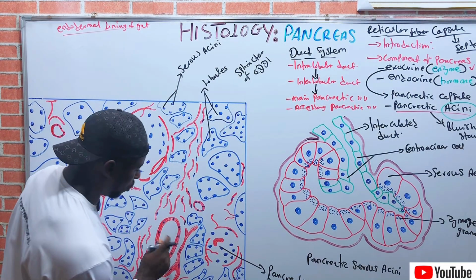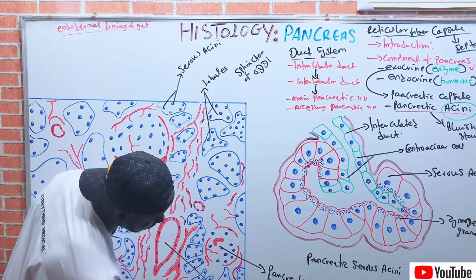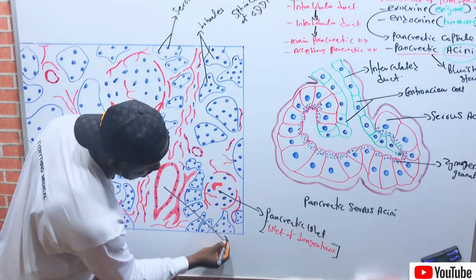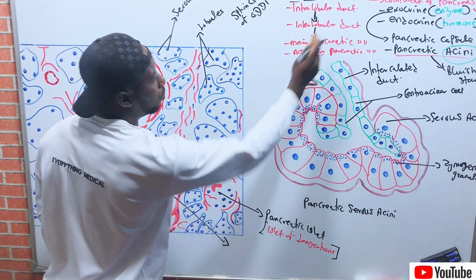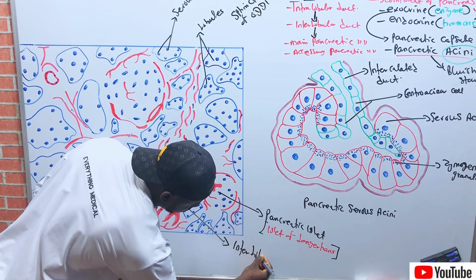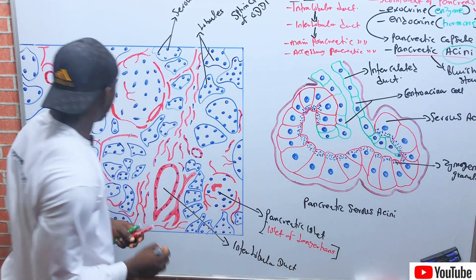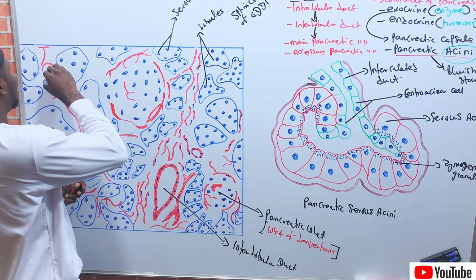So here is that duct. It is called the interlobular duct.